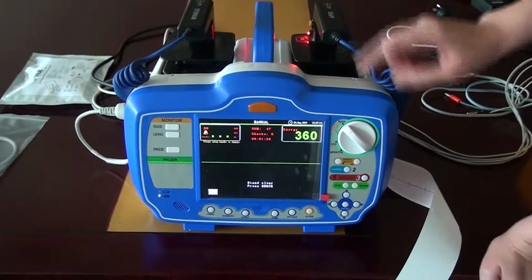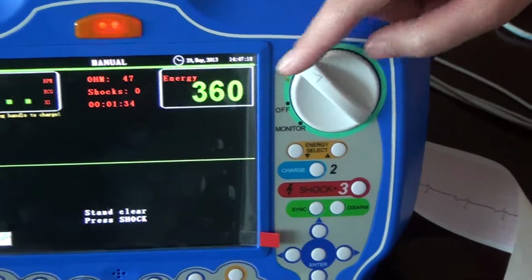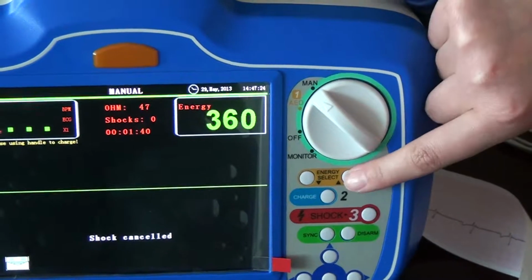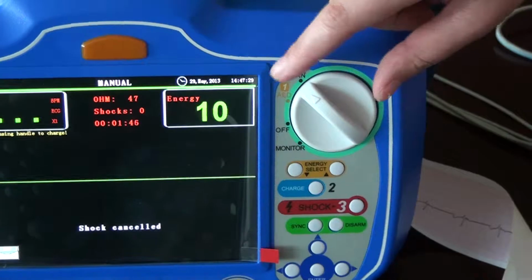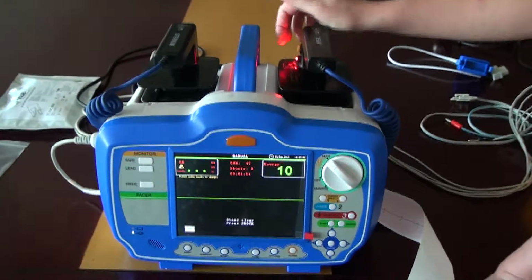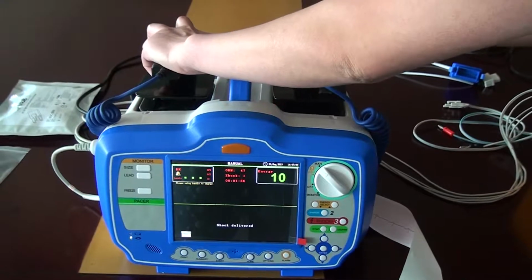And actually, we usually do not use the energy 360. We use less energy, so select it. Shock cancel. Such as 10 joules. And to have a self-test, just press the yellow button. Stand clear. And when it is red, then press the 2 red buttons to shock. Shock delivered.